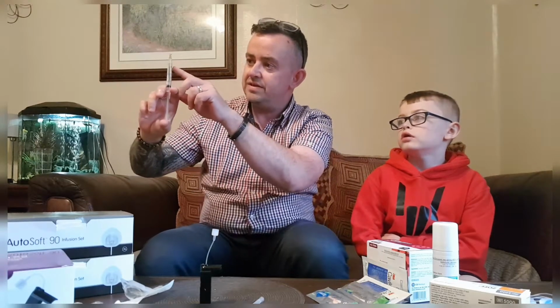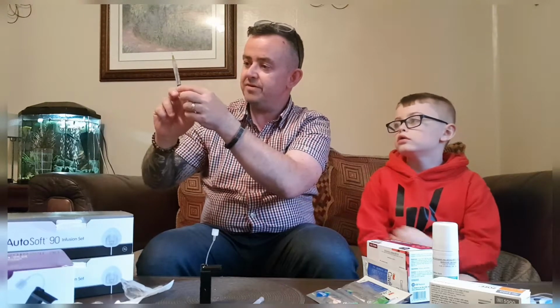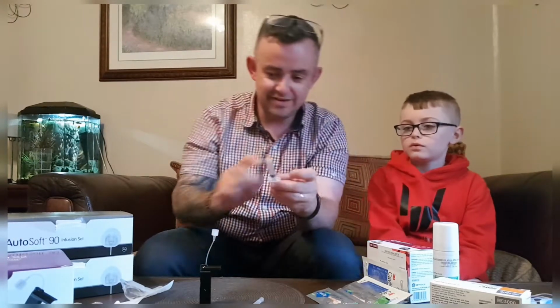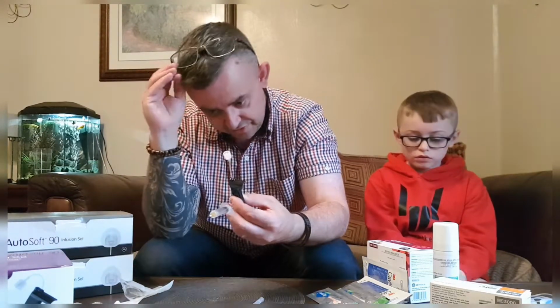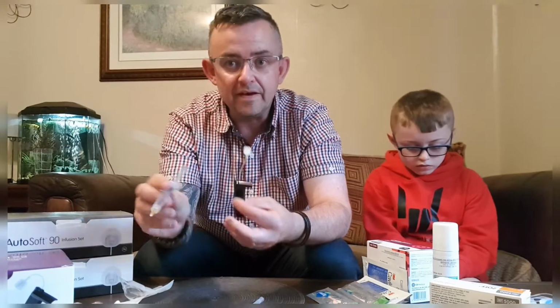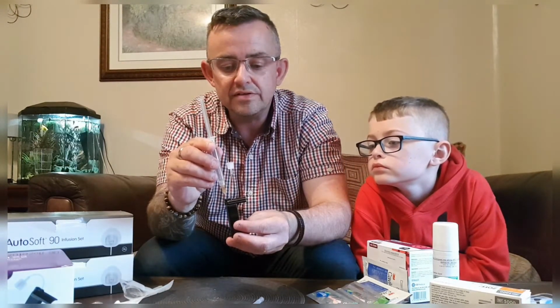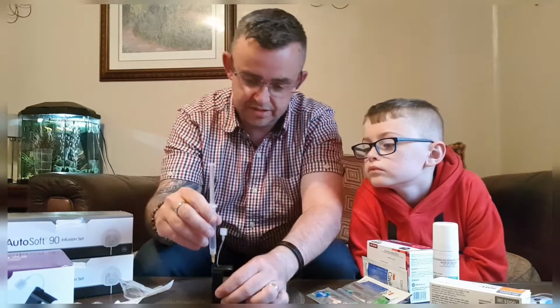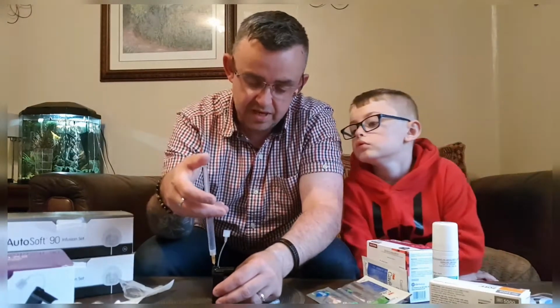You can see I need to get to about there. There we go. Is that 3 ml? Yep, spot on. So we take the cartridge and then we take our filled syringe, pop that in there. You can feel it when it stops.